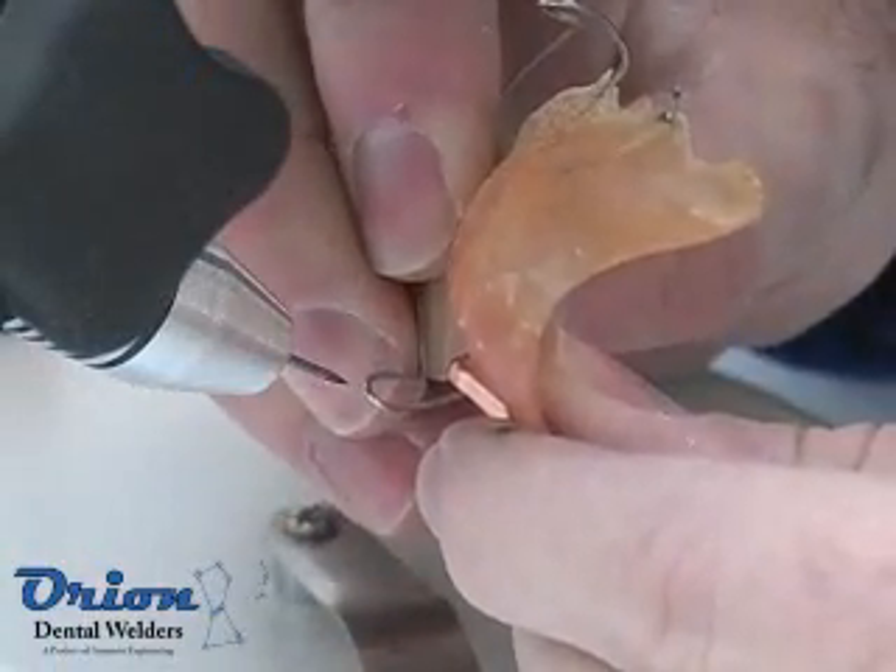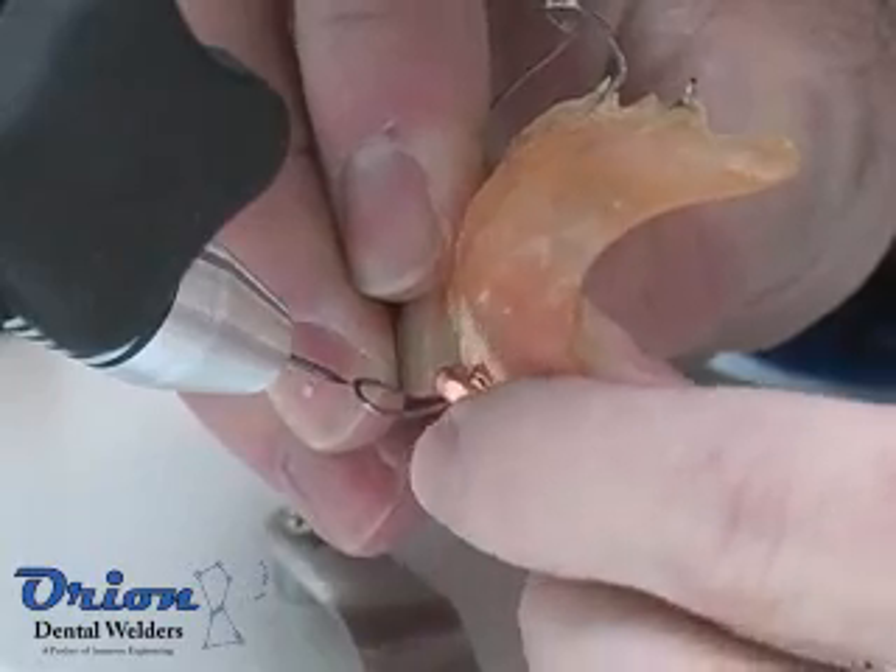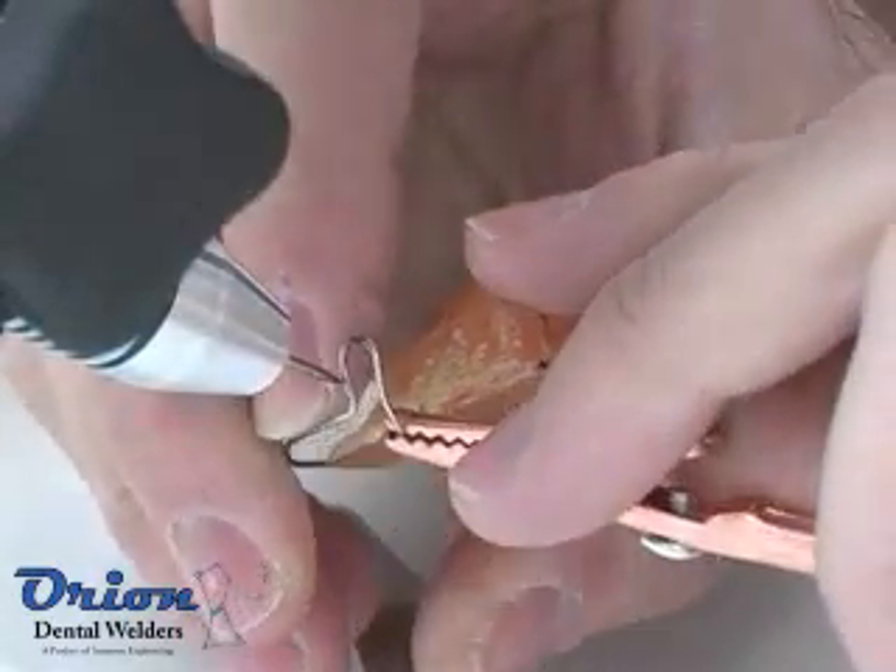In Micro Pulsark mode, the welder can be used for extremely intricate welds on fine features or small parts. Micro mode can be adjusted down to 1 watt second.